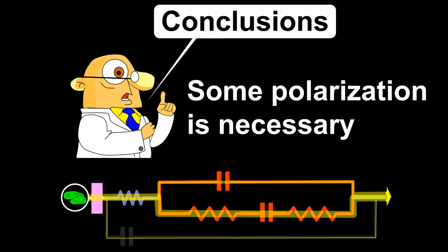I have made the lines going through the resistor, Warburg impedance leg of the circuit thicker to indicate that more current goes through this leg of the circuit than through any other. Also note, the arrow in this frame is going towards the machine. In this new frame, all is the same except for the arrow pointing to the scalp. I have done this to indicate the reversibility of the process.